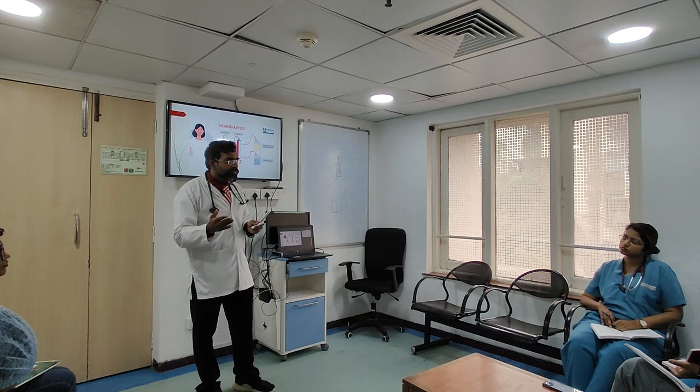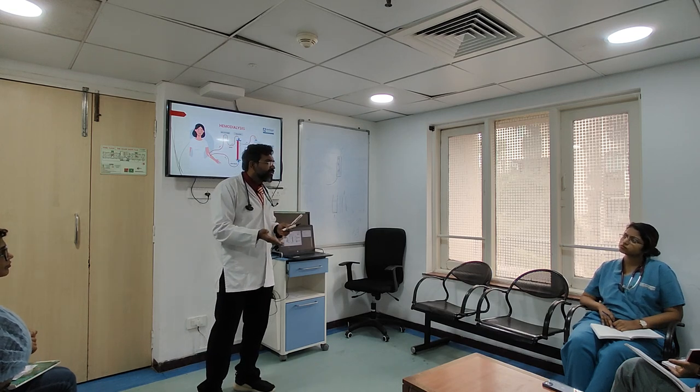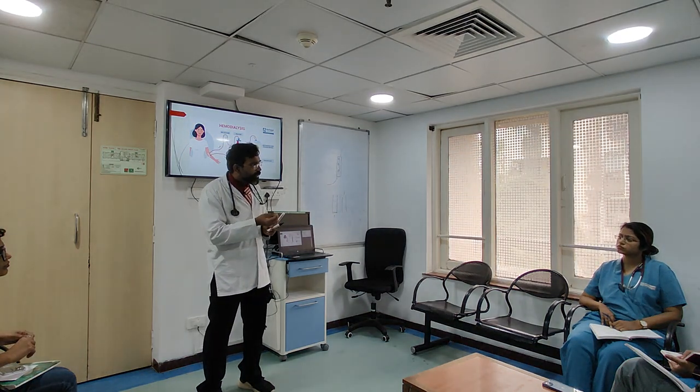Why? Because the potassium will quickly move. You are running at a rate of 200 to 300 ml per minute, so you are practically moving the blood very quickly, and the potassium will become almost equal to zero. It's not going to approximate, it's going to move. So it can be quite disastrous and dangerous. That is why classically, 0K should be only for an hour or maybe half an hour, not more than that.